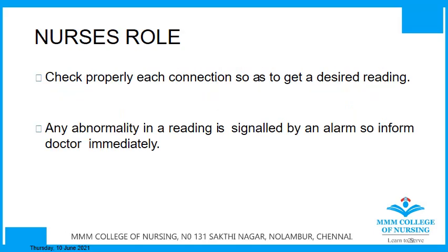But moving on to the nurse's role. In each shift as a nurse, you are responsible to check properly whether the connections are giving a correct reading. An abnormality in a reading is signaled immediately by an alarm. So if it is so, inform the doctor or the physician immediately.